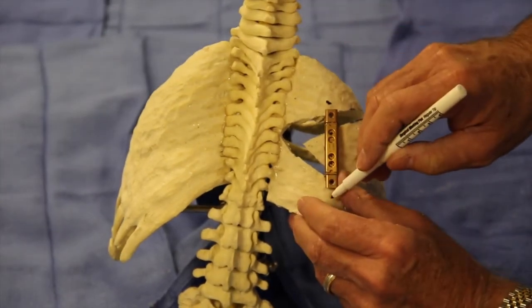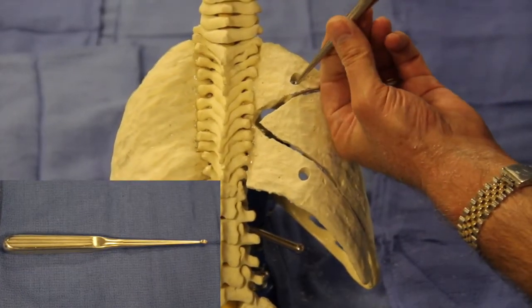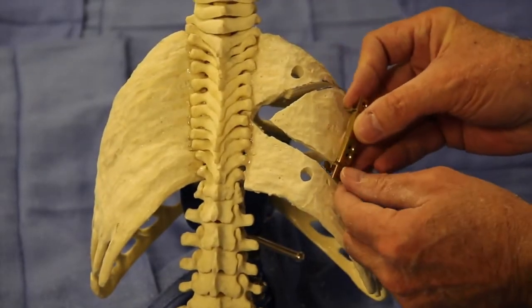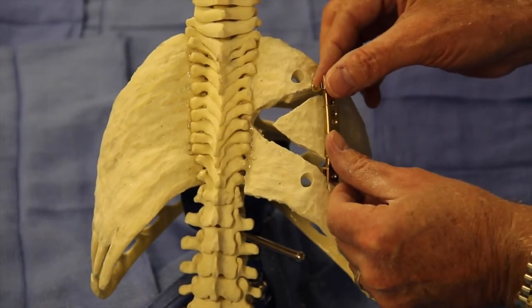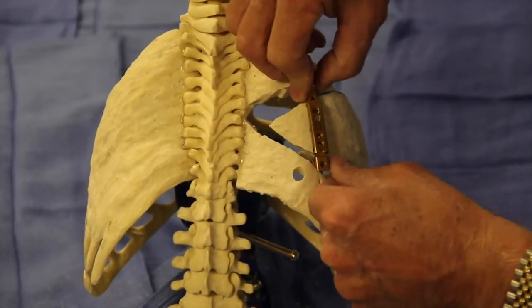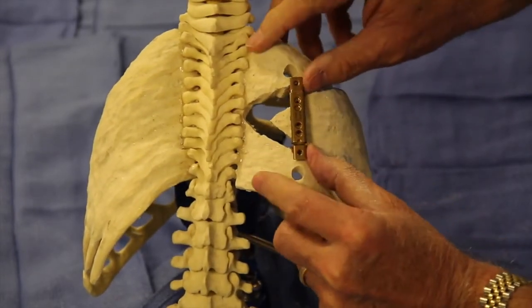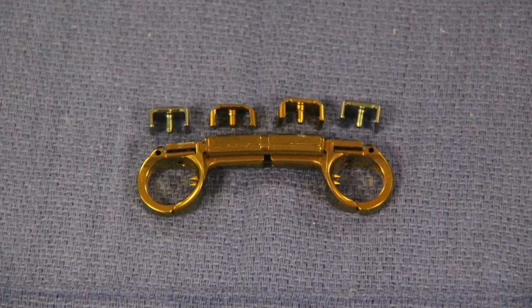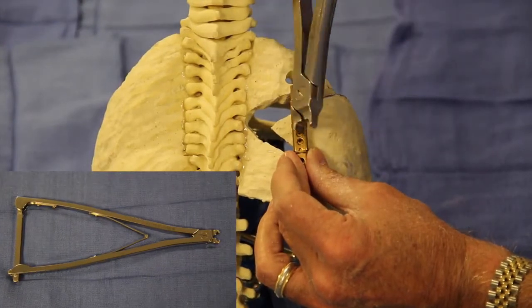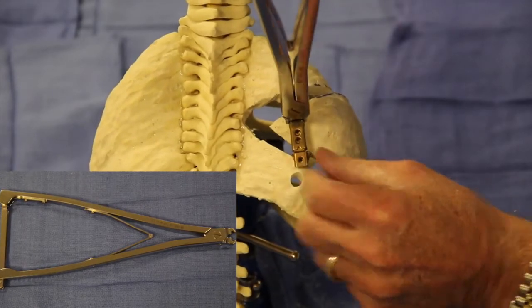You mark proximally and distally where the rib cradle caps are to be placed, using a burr and also a curette to form a hole large enough for them. Then you place the device back into the fused rib mass through the osteotomies, and then wedge it medially until it approximates the holes.